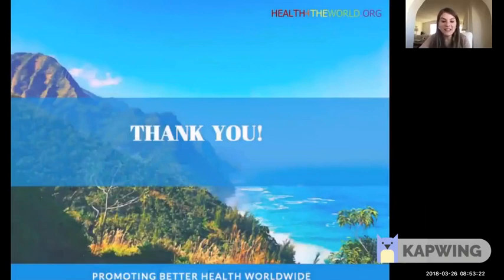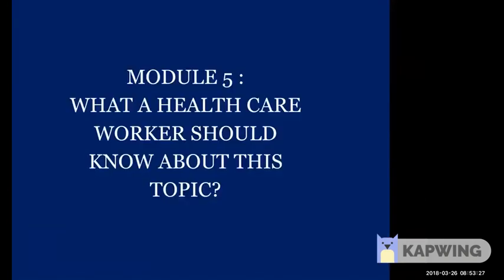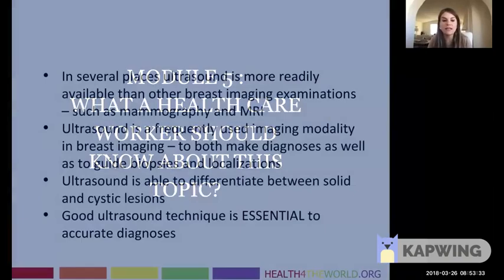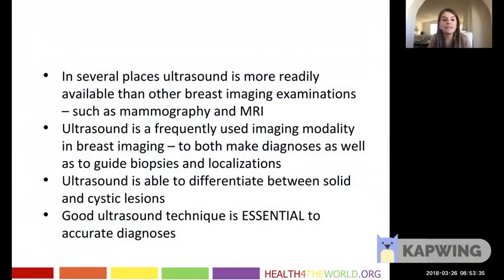So I want to thank you for your attention with that. And just moving on very briefly to 2 slides. The first for Module 5 on what a healthcare worker should know about this topic. Well, I think in several places, ultrasound is going to be much more readily available than any other breast imaging examination, such as mammography and MRI.